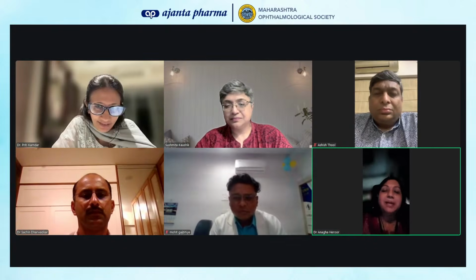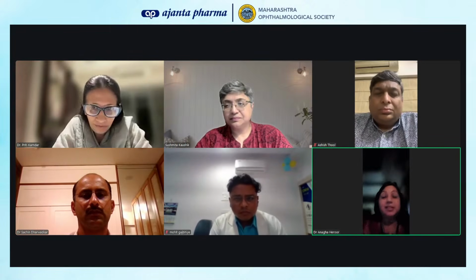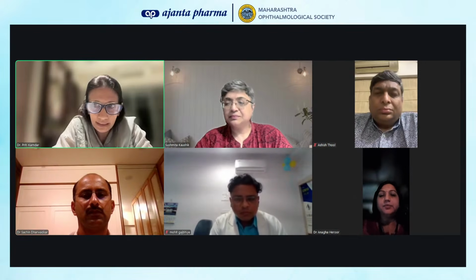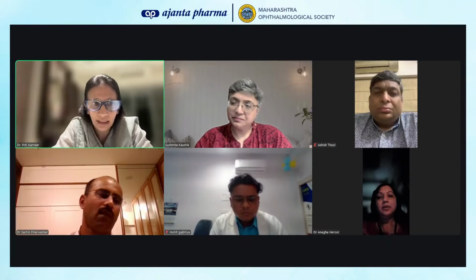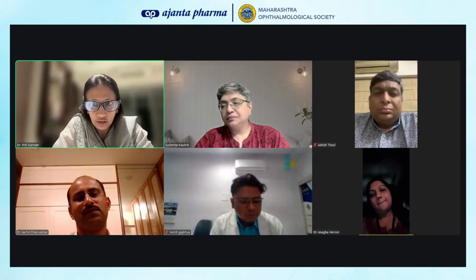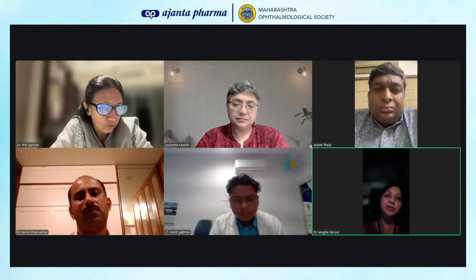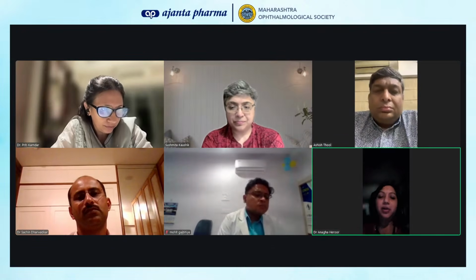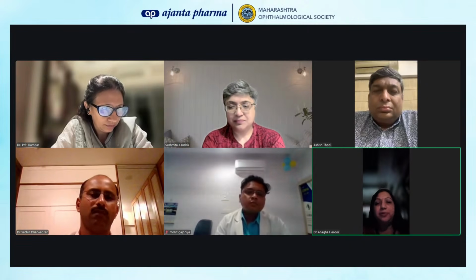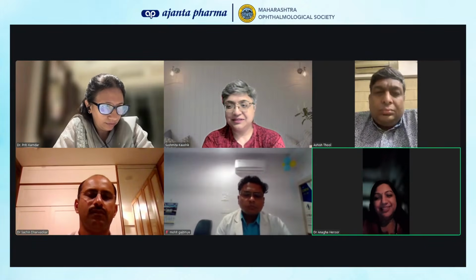And did we speak about family screening? I mean, in case of very strong family history. Because it is the Glaucoma Awareness Month, and just to complete the glaucoma suspects, we did speak about it, but not particularly screening. All patients who have relatives are glaucoma suspects in that sense. So would you screen, and what all would you do? Like a son of a patient who has had moderate glaucoma, what test would you advise apart from just the clinical examination of the optic disc and eye pressure?